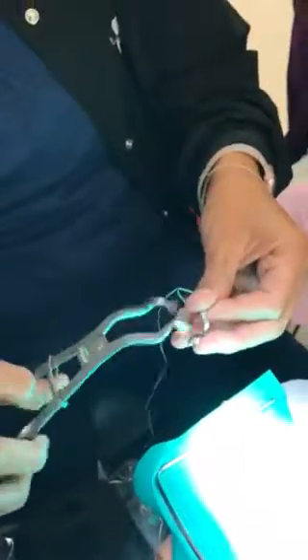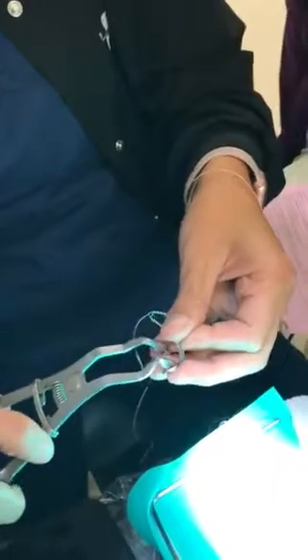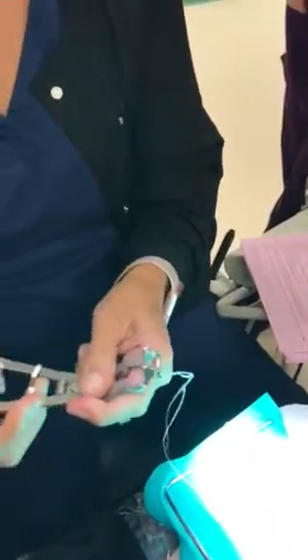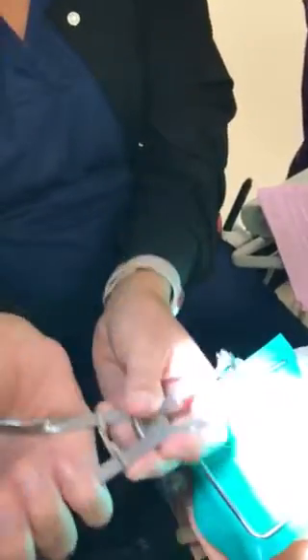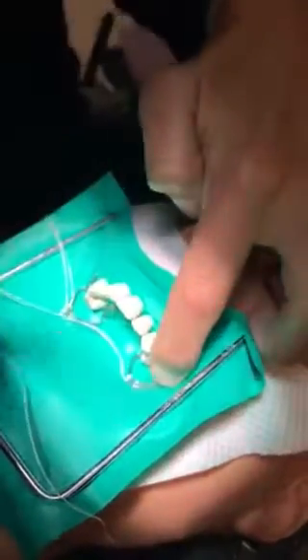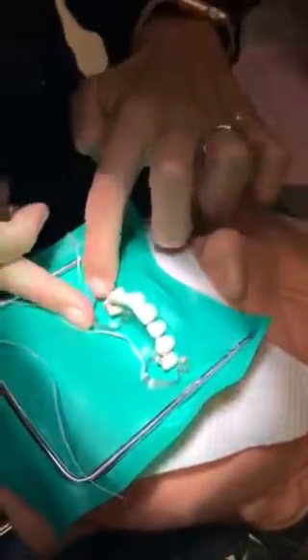And again, I'm going to put the little projections in the holes, open it up, lock it into place, well, if it will. Then I got it in my palm, I'm going to go from the lingual, sit it down on the gingival, over the buccal, and place it down. Okay? And now it's on. And so now I'll just move this little floss over this way, and so now it's in place and the doctor can work on the tooth.